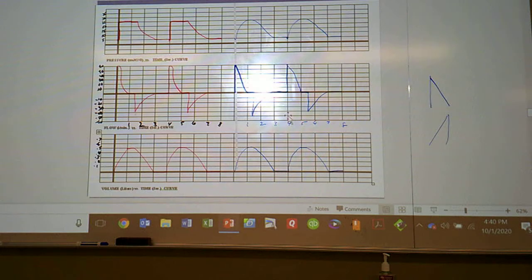If you notice, I'm doing it right on the second mark. I'm doing that purposefully. They're all on three seconds. It makes it a whole lot easier. One, hold it for half a second. Yep. And wherever your flow's coming back to zero, your volume has to come back to zero. And your pressure has to come back to baseline. And then hold that for a second.